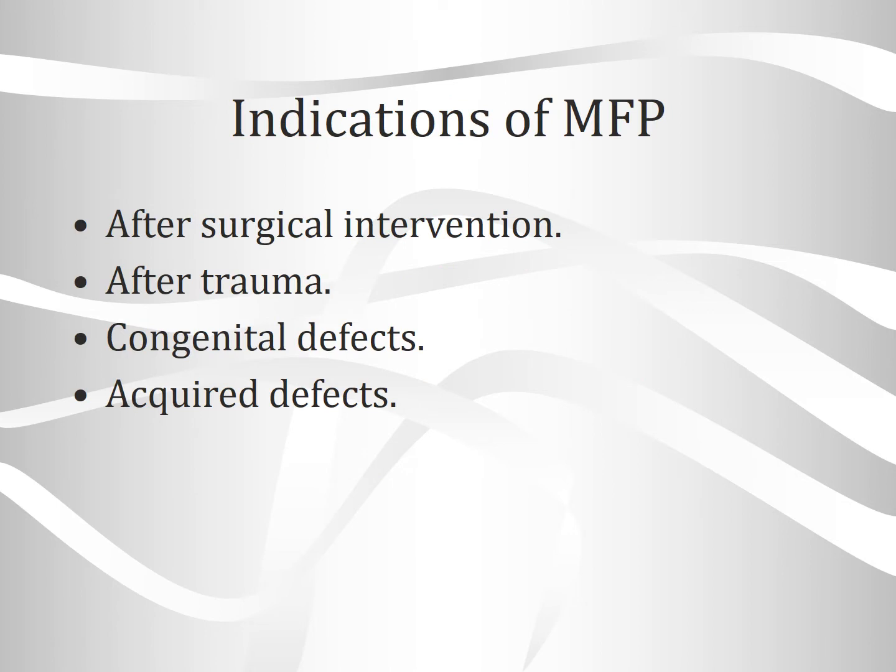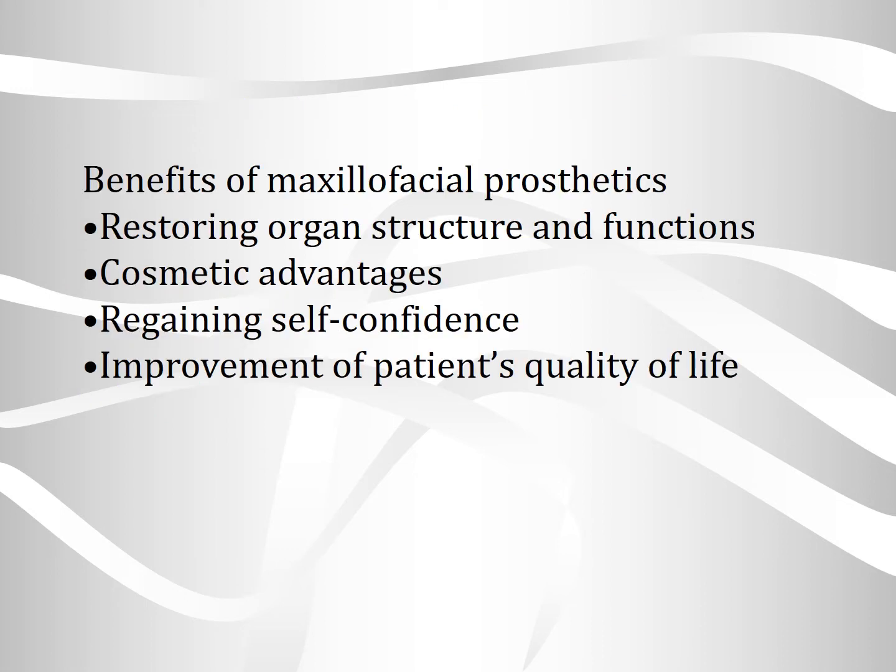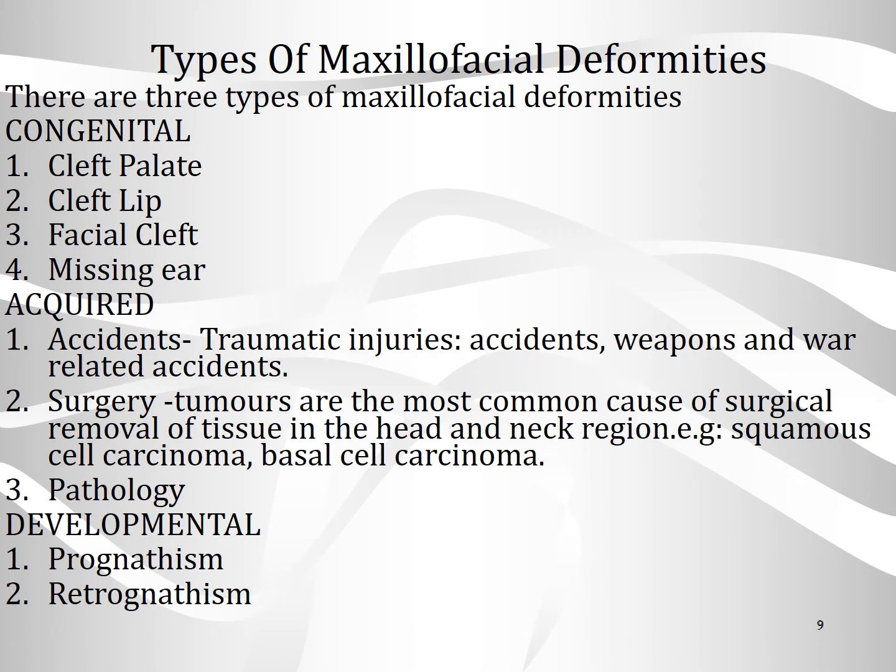So, indications for the MFP, that is the maxillofacial prosthetics, are after surgical intervention, after trauma, congenital defects, and acquired defects. Benefits of maxillofacial prosthetics are restoring organ structures and functions, cosmetic advantages, regaining self confidence, and improvement of the patient's quality of life.